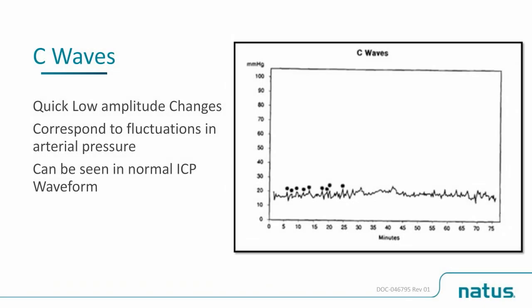And finally, C waves represent a normal variation of ICP. This is why your ICP is labile, meaning that very rarely does a patient's ICP remain static. It will be up and down with very small, quick variations of just a couple millimeters of mercury. So when we talk about Lundberg, A waves are bad, B waves can turn into bad A waves, and C waves are normal.